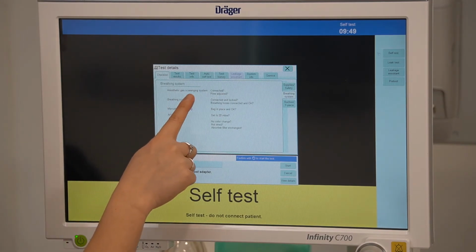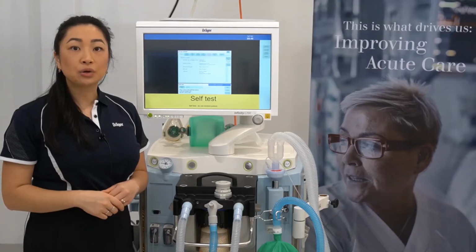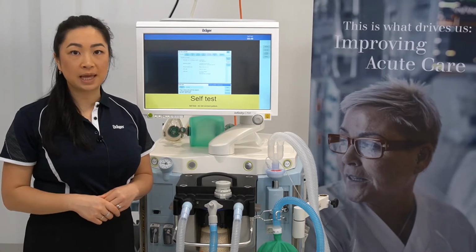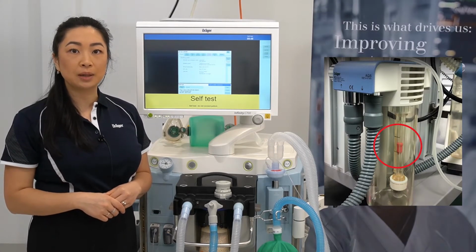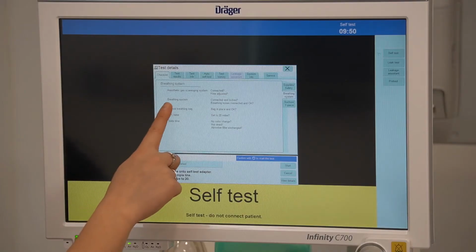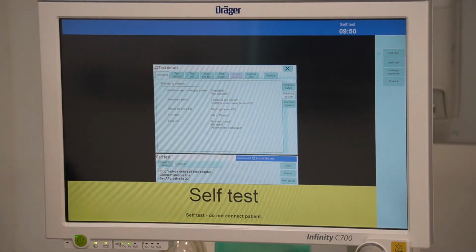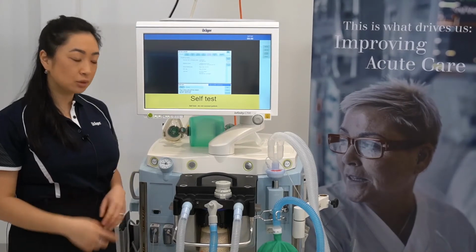To verify your central gas supply is plugged in and indicators are green, an LED light above oxygen air indicates that we are connected to central gas supply. If the central pressure was low or not connected, there will be no LED light indicated. In this instance, nitrous is not connected via central supply.